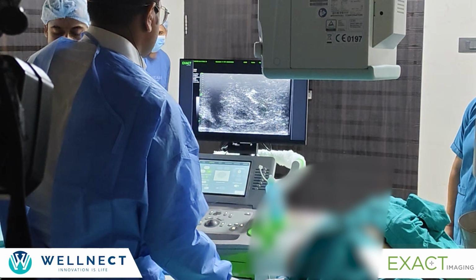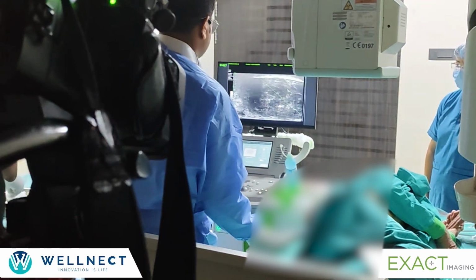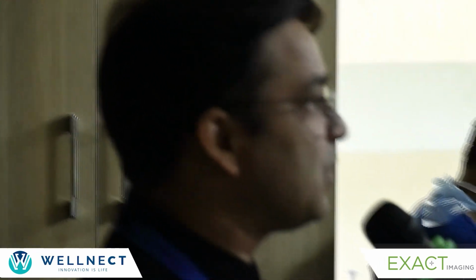Okay. Can you appreciate these biopsy marks? Yes, sir, we can clearly see. These tracks which are seen, we got the imaging showing. Imaging which can show you the track nicely, you can reframe your biopsy site again so that you don't take a biopsy again from one point. Right? You can change your location. Even in follow-up it can help you.